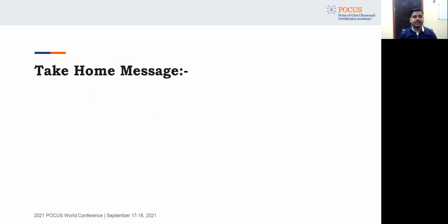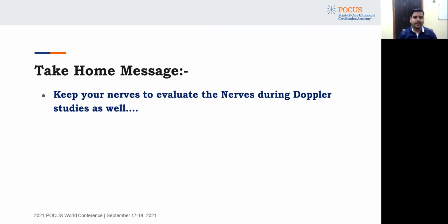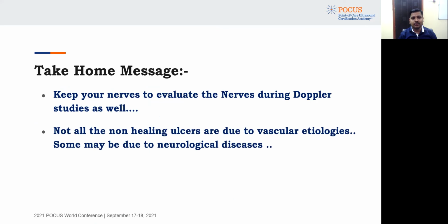So at the end of this presentation, my take-home message is that you should always keep your eyes open to evaluate the nerves during the Doppler studies as well. Not all non-healing ulcers are due to vascular etiology. Some of them may be due to neurological etiologies. So always look for nerves, even if you are doing a Doppler study.